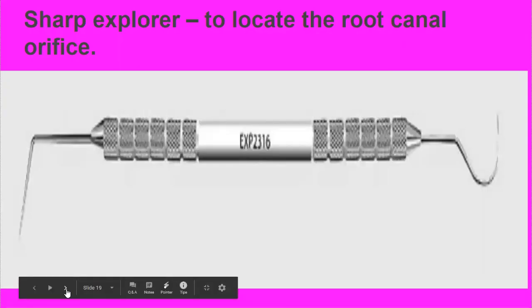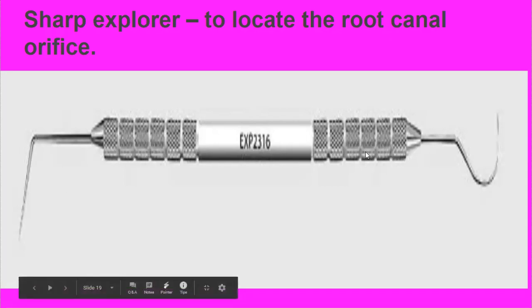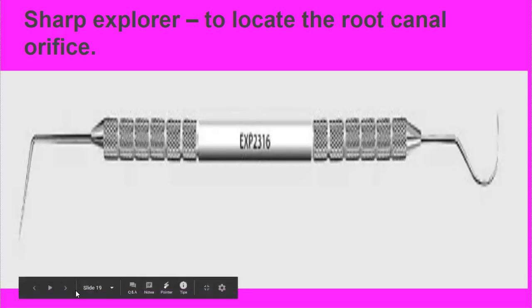All right, this is a sharp explorer. It's just a regular explorer on this end. Okay, but over here you have an endo explorer.